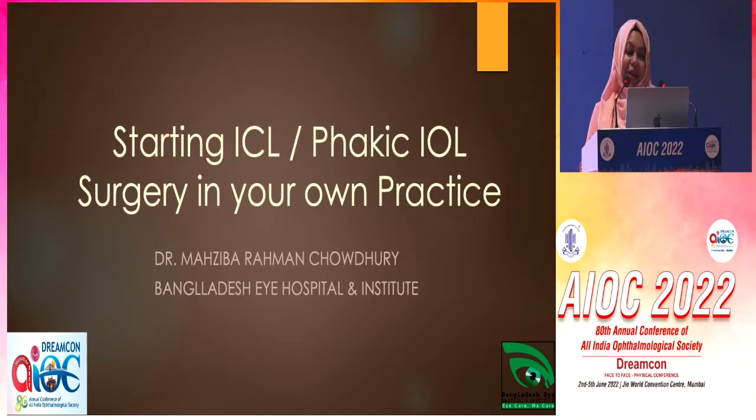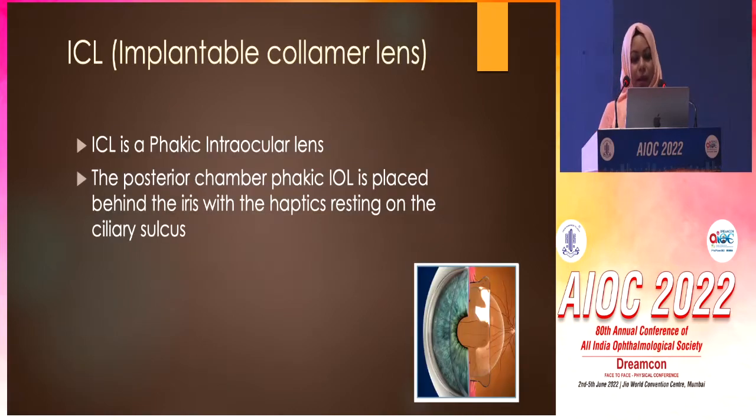Respected delegates, a very good afternoon to you all. ICL as a whole is not as popular as the other refractive surgeries. So in my presentation, I'm going to say how I incorporated ICL in my practice. ICL is a phakic intraocular lens. I'll be specifically talking about the posterior chamber one because that's the most commonly used and that's what I have been using.